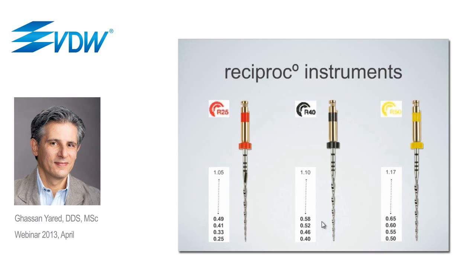Then there is the R40, which has a diameter of 0.4 millimeter at the tip, then a 6% taper over 3 millimeters, then the taper decreases beyond that point. The R50 has a diameter of 0.5 millimeter at the tip, a 5% taper over 3 millimeters, and then a decreasing taper.